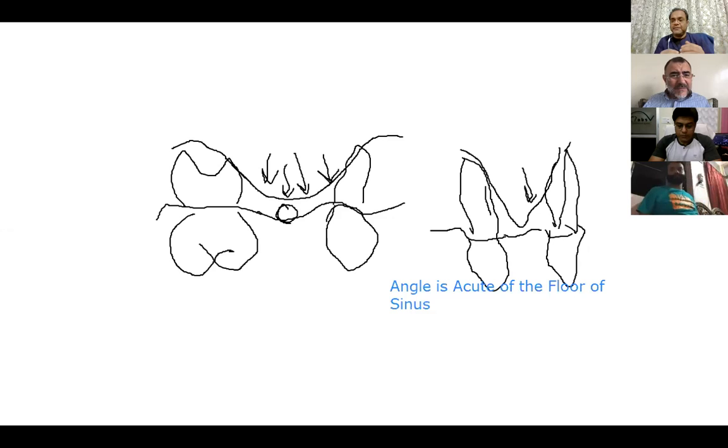But here we are doing it simultaneously. So I believe the bone implant contact ratio becomes less, and that is why people prefer the lateral approach, wait for 6 to 8 months, and then place the implant so that there is a conversion. What do you have to say about that?